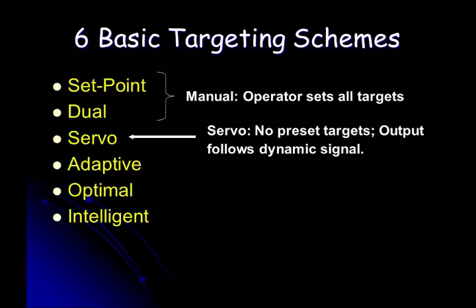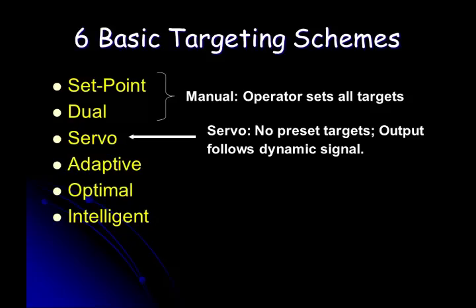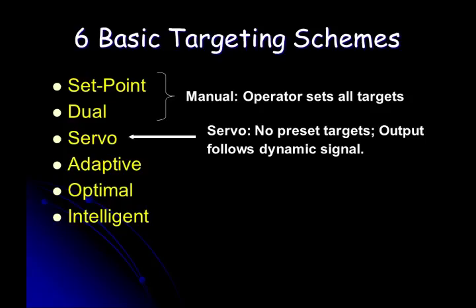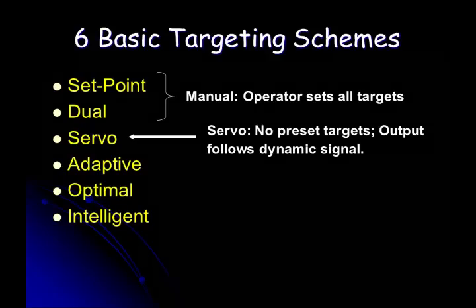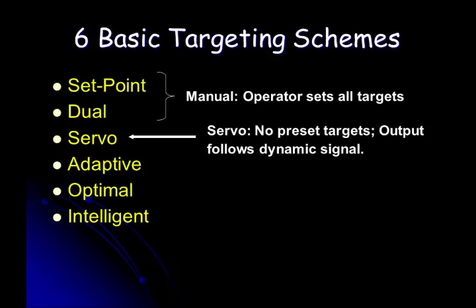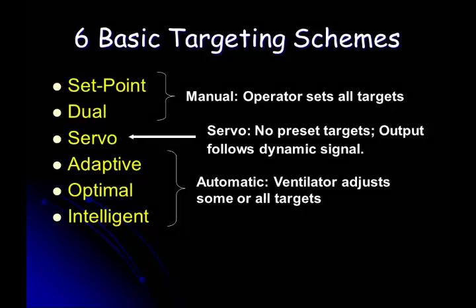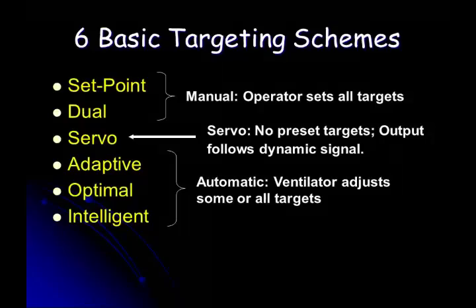So servo is not just the name of that. That's correct. The term servo means basically something where there's a feedback mechanism. So your cruise control is a servo-controlled speed mechanism. No, they just happen to steal the name. The term servo actually goes way before the company stole that. And then there's 3 that we're going to talk about where the ventilator changes itself based upon what it sees. So you start having this piece of silicon take over the function of ventilation.